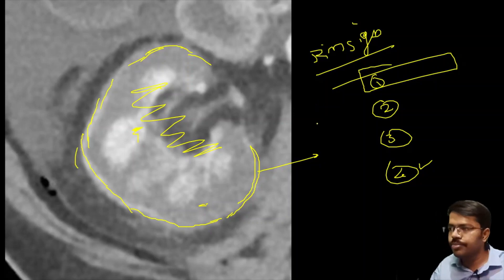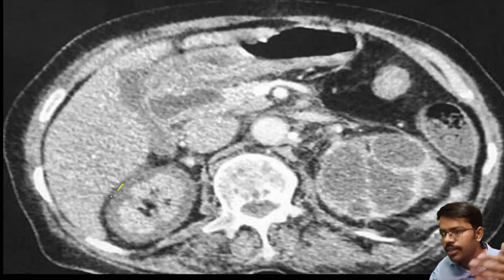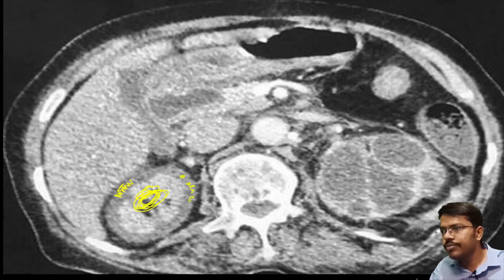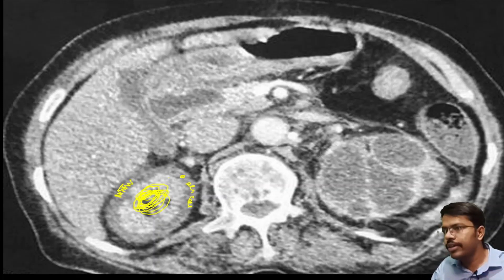For the reverse rim sign, even the cortical perforating branches show no enhancement — only the medulla is getting enhanced and the outer cortex is not enhanced. So this is the reverse rim sign: the inside part is enhanced and the outside part is not enhanced.